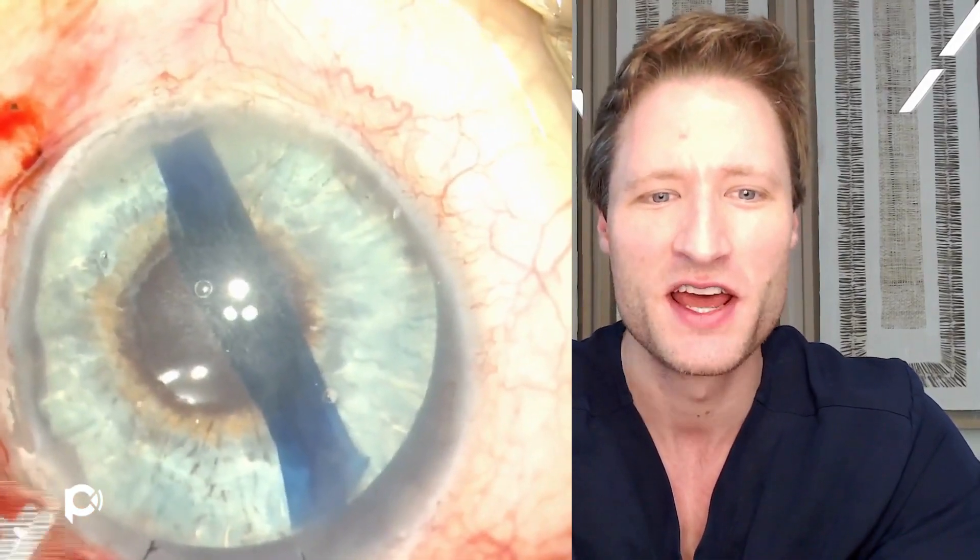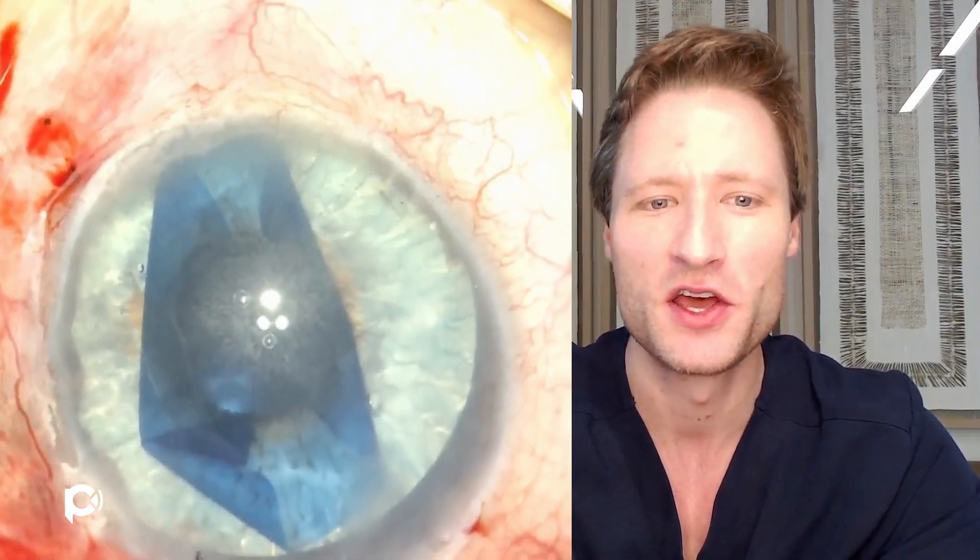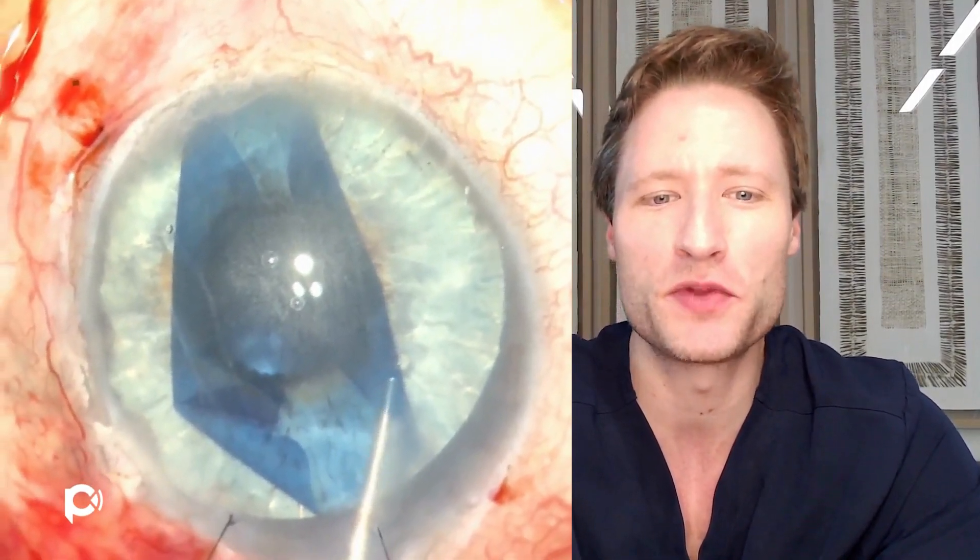We've just injected the DMEK graft and now we're unfolding the graft on top of this artificial iris. With a jet to deepen the chamber and just a few taps on the corneal surface, you'll notice the graft just starts to open right away.